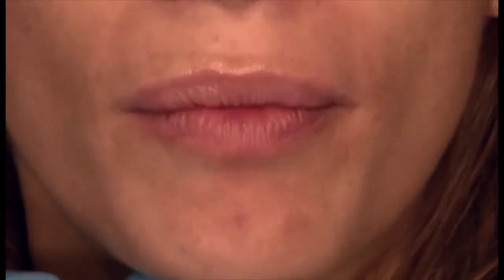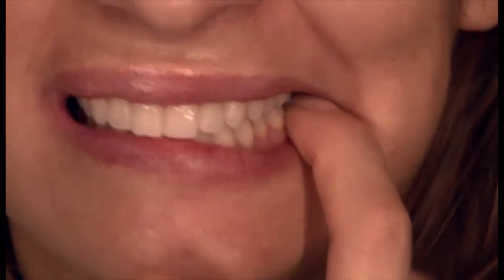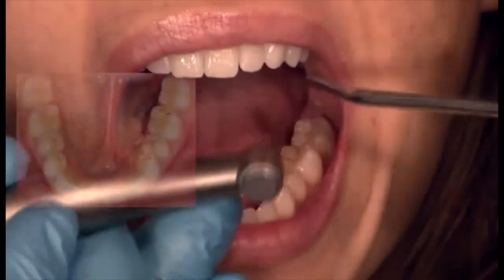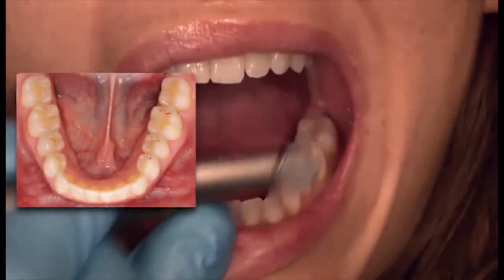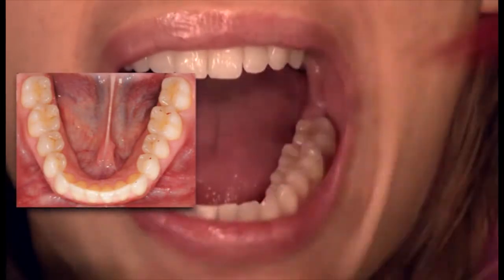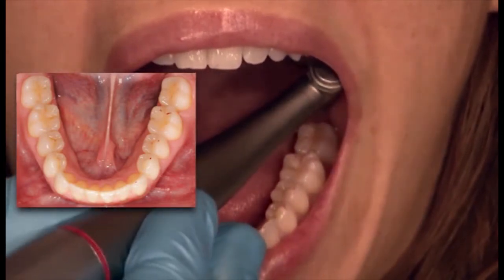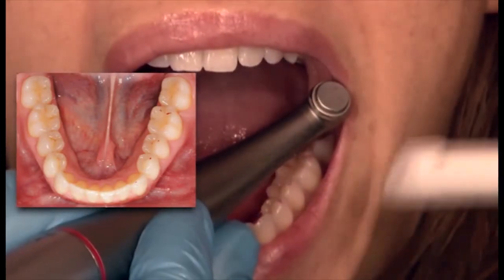Tap up and down. Did that make a difference? Yes. That means I was in the right place. Now where do you feel it? Further back. So I saw that red one. That was on that incline, right on that molar. Tap up and down. Open. So there's an incline contact on the molar. I'm actually going to smooth that one out.